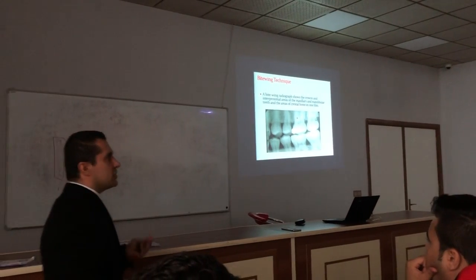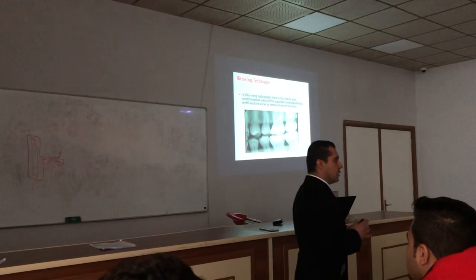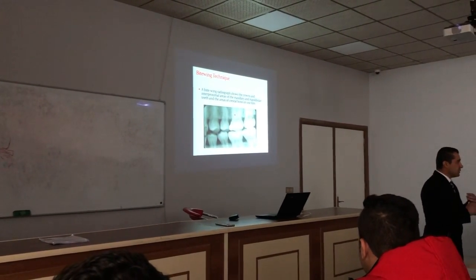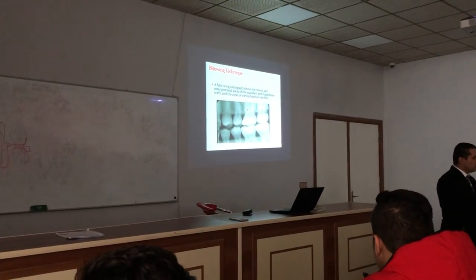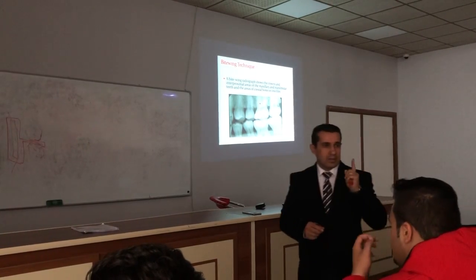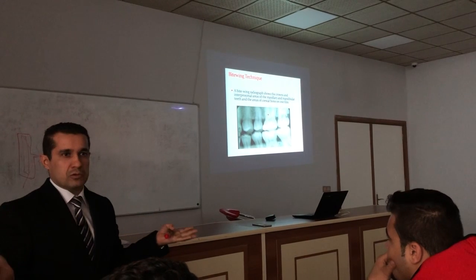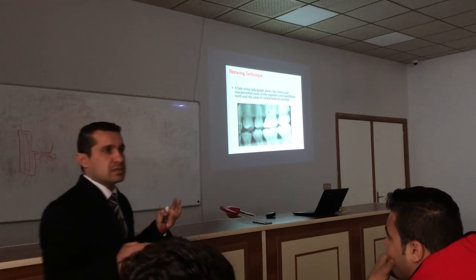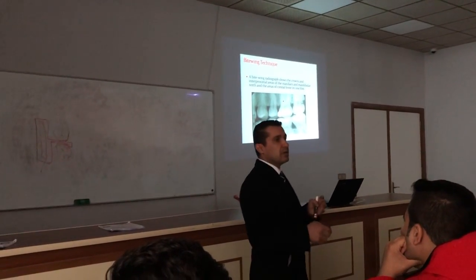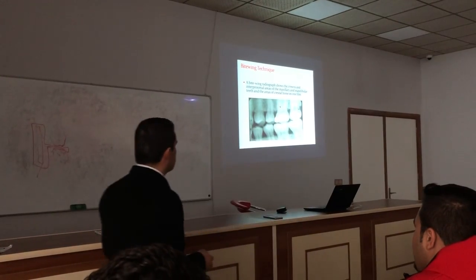Or for example, a patient complaining from the tooth during cold or sweets. Keep in mind, any patient who comes with sensitivity to cold, and to sweets, it means you certainly have caries. In this case, clinically you see nothing, you see a sound tooth, but when you take a bite wing, you will see that there is mostly proximal caries, either on the mesial or maybe the distal side.